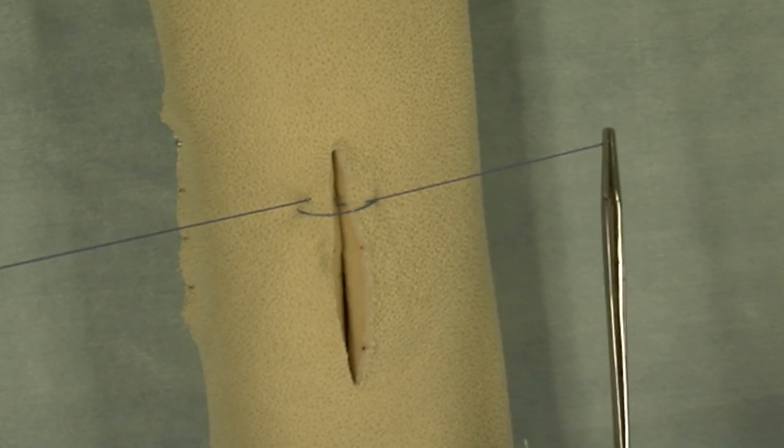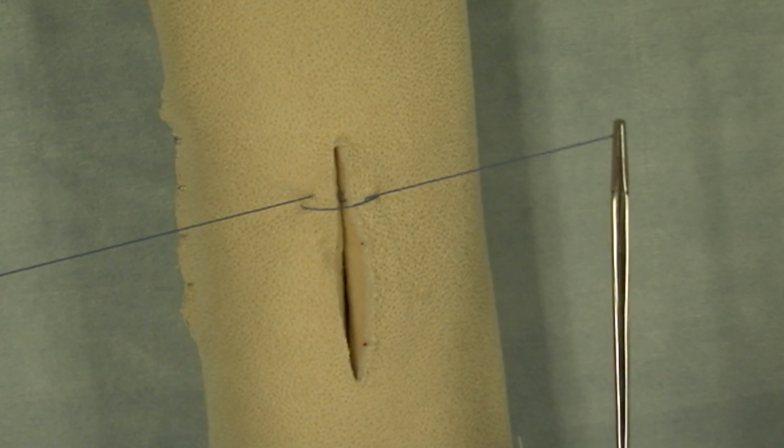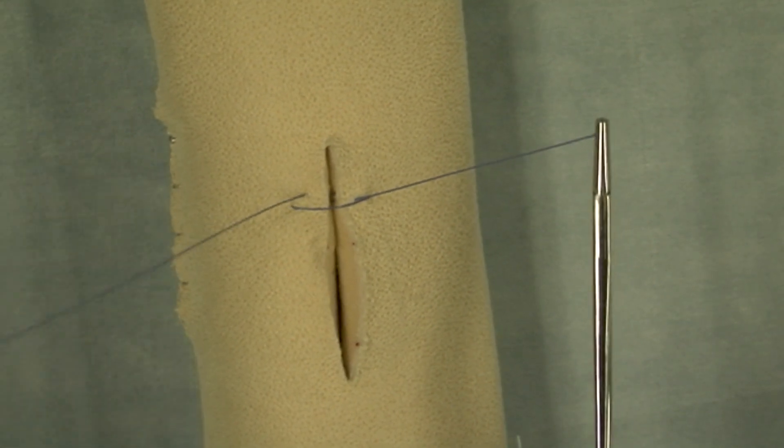I want to tie straight across the incision. Now you can see how the suture pattern actually takes up tension very nicely.